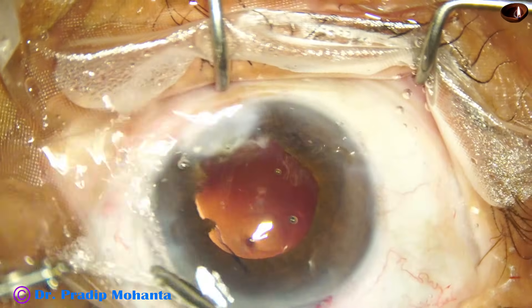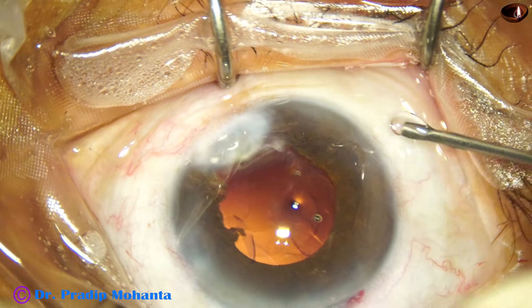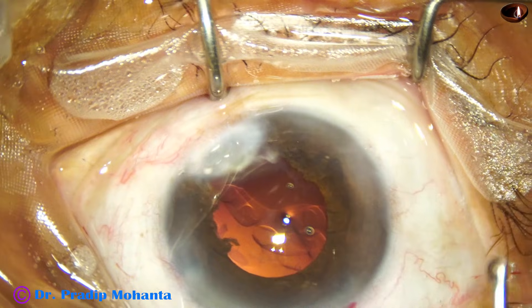We should not catch the iris. If we touch the iris, the pupil may become very small.